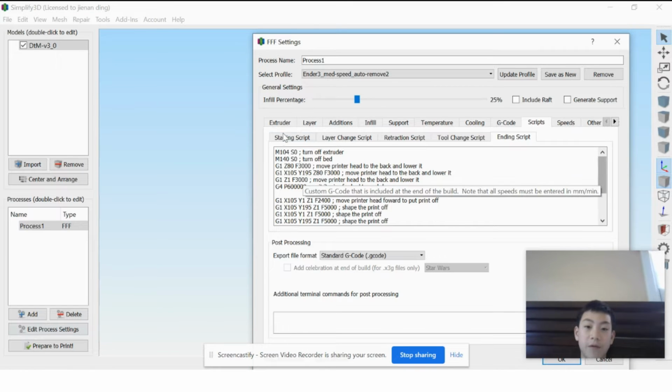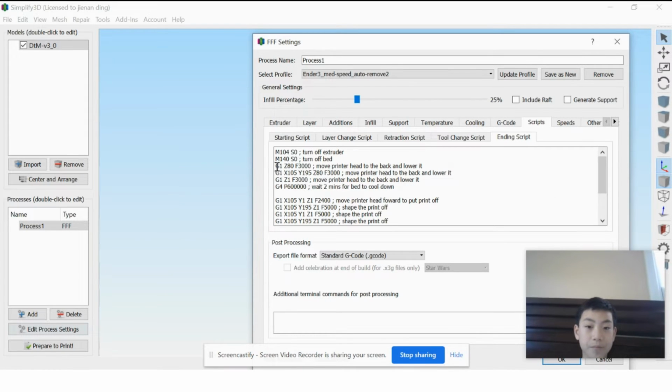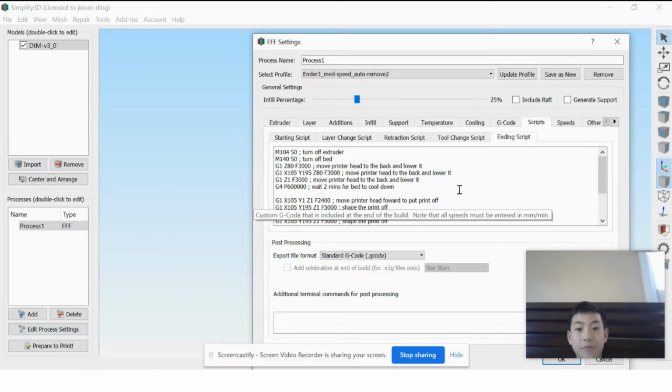Alright, ending script. I've already written stuff here, so I'll just go over it. You will want to turn off your extruder and bed first. For the bed, you don't want it to stick, and the extruder so it doesn't burn the print. Next, you will move your printer head to the back and lower it so it can get ready to push it off. Here, this is just getting it to the back and lowering it, all three of these.